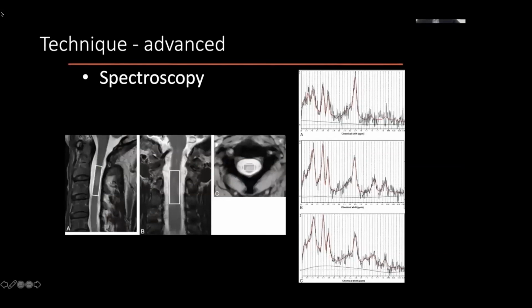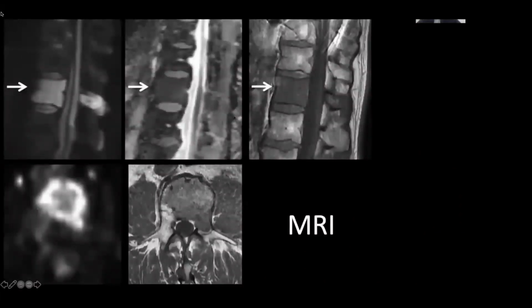I think that speaks to the fact that spectroscopy really has been around a long time, and hasn't necessarily materialized in terms of its utility as a lot of people thought that it would. But in theory, you can differentiate different tissues and achieve a sort of virtual biopsy. But in reality, it's used kind of infrequently as a problem-solving modality.